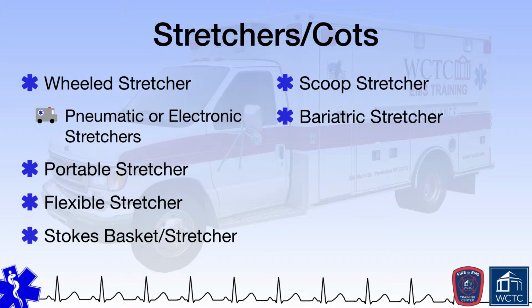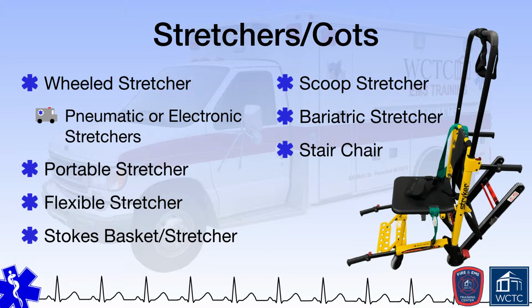EMS providers are often called upon to move patients up and down stairs. Stair chairs were designed to facilitate such moves. Stair chairs are essentially chairs that are engineered with wheels, treads, seatbelts or straps, and handles to make the job of moving patients up and down stairs easier for EMS providers. Stair chairs are typically foldable, making them easy to store in an ambulance compartment until needed.